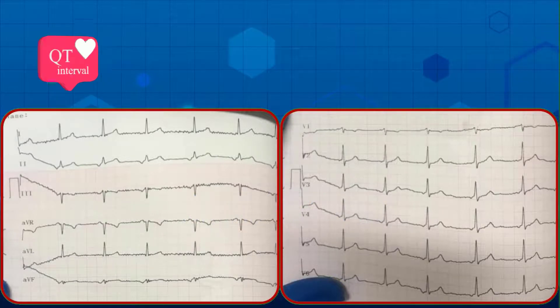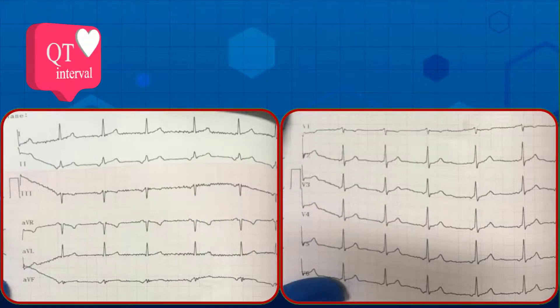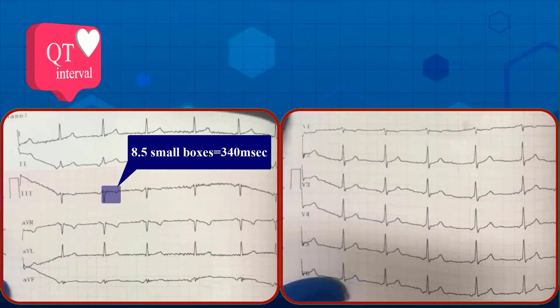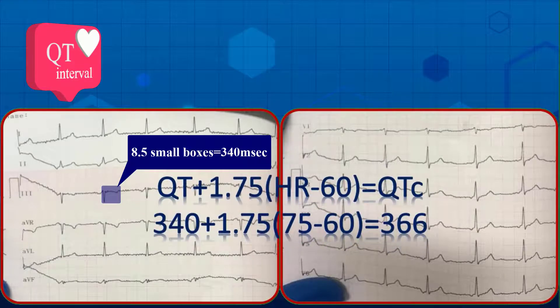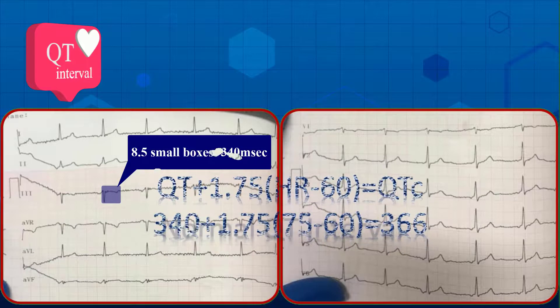Next part is the QT interval. The QT interval is about 8.5 small squares, therefore the QT interval is 340 milliseconds. Since the heart rate is 75 beats per minute, the corrected QT interval according to the Hodges formula is 366 milliseconds, and therefore is normal.